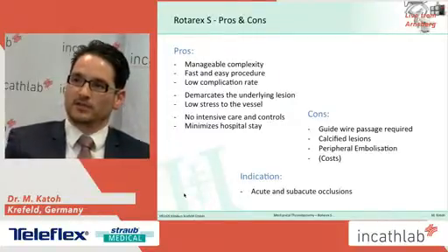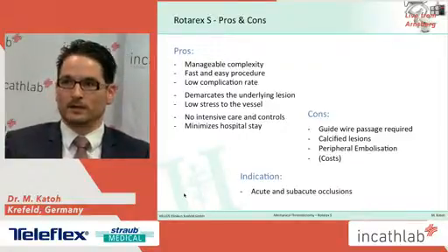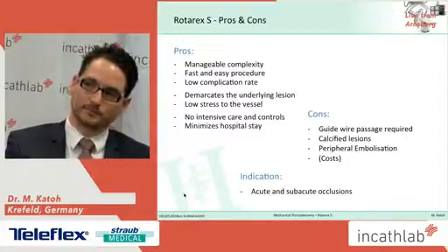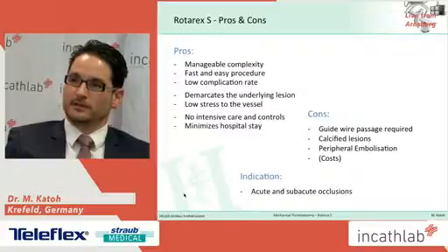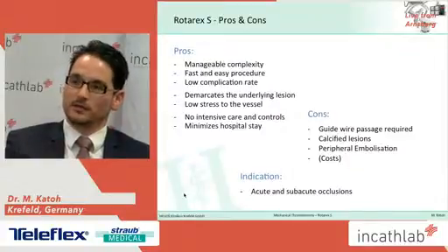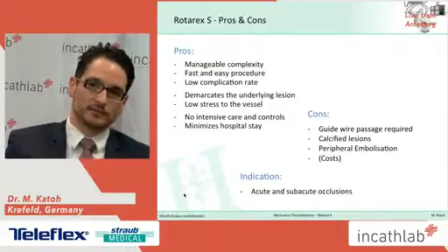It allows to demarcate the underlying lesions if there are any, and allows to treat the occluded vessel with the lowest stress possible. The procedure does not need any intensive care monitoring of the patient and doesn't need any control angiography again. It therefore minimizes the hospital stay and costs.